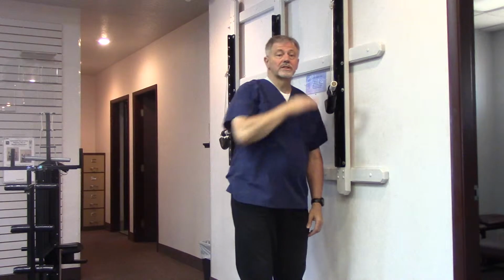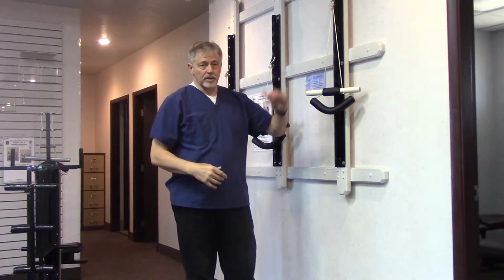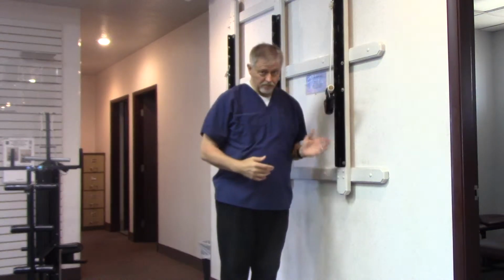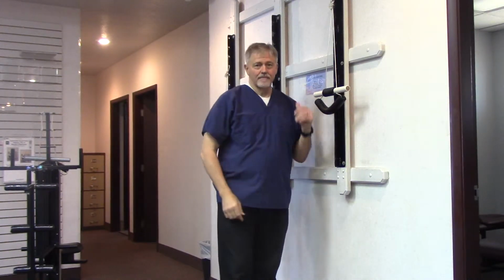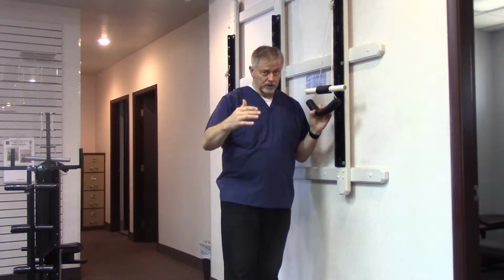There we go. It's coming to the top of my shoulders here. That's my optimal position. And so we want to make it so that it's everybody's optimal position. That's why we have this rack here. And you thought a rack was a country. Yeah, here it is. So we're also going to make sure that you know how to modify yours at home.